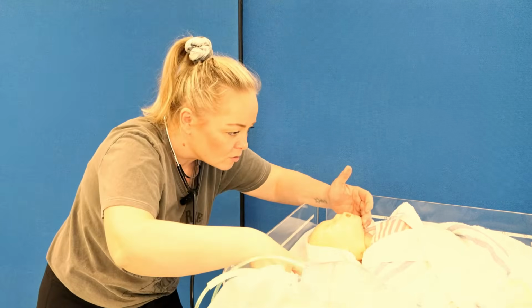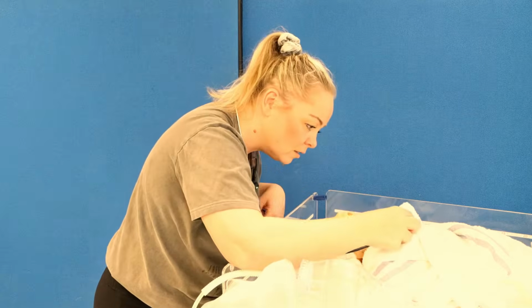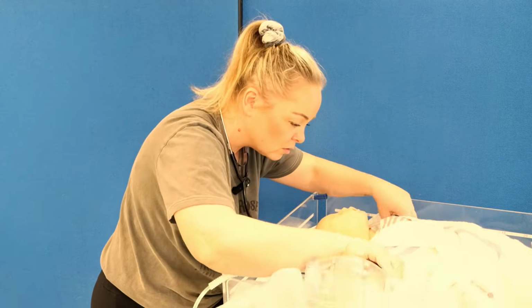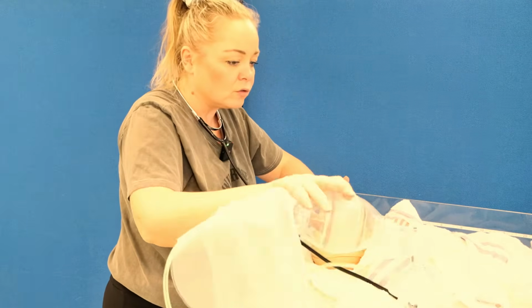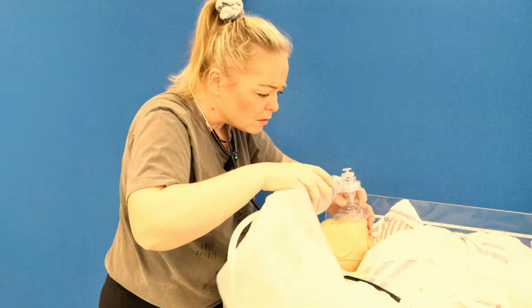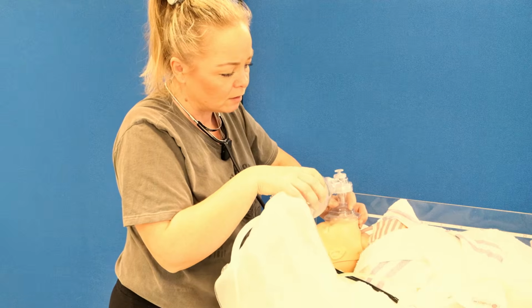So I did see chest rise. There's no spontaneous chest movement. Heart rate's still below 60. And there's no tone, and they're still quite blue. So I'm going to move on to my ventilation breaths for 30 seconds.